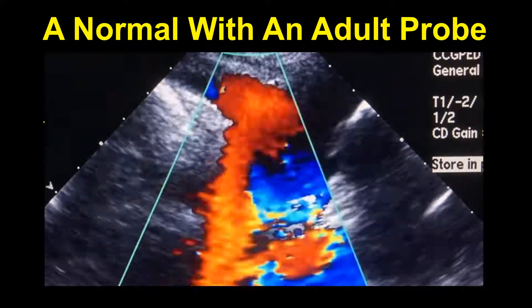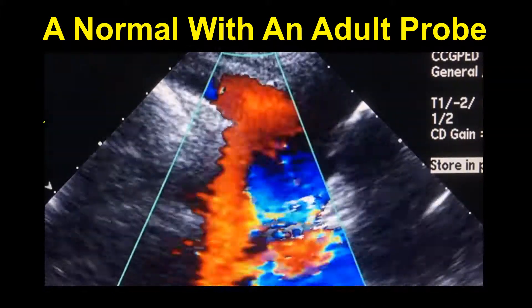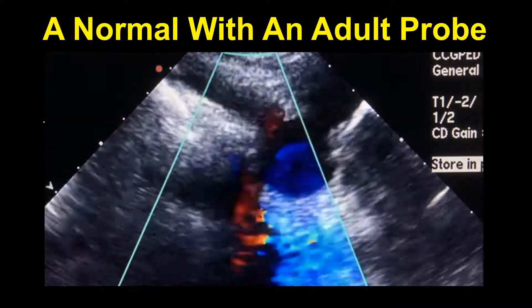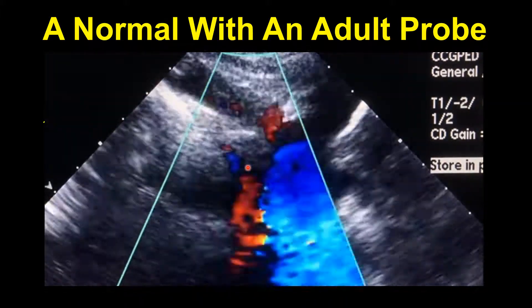Here is a normal view with an adult probe. This is our arch-sidedness view, which we have to do in every patient. We can see the innominant artery goes off towards the right shoulder, and this tells me that this is a normal left aortic arch.